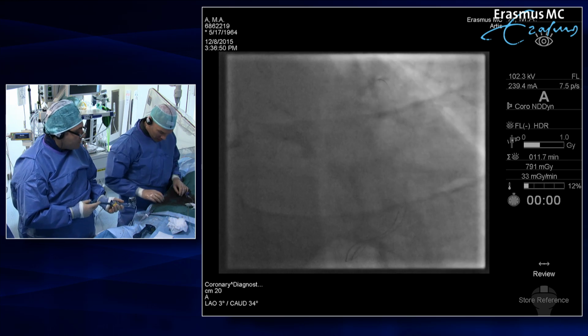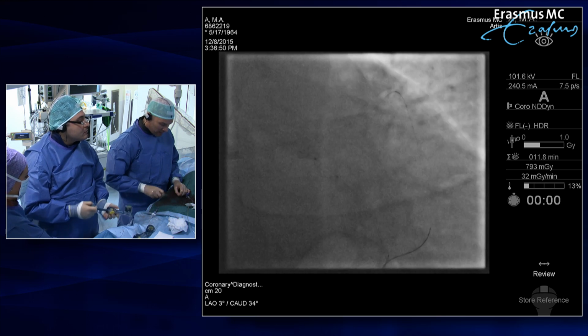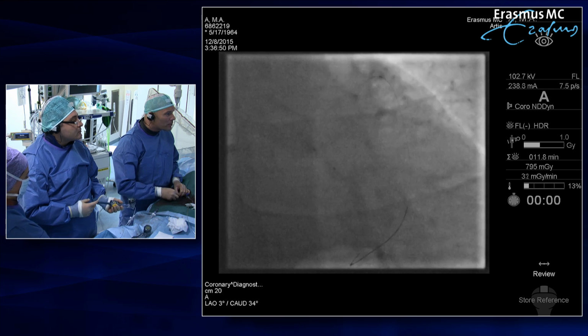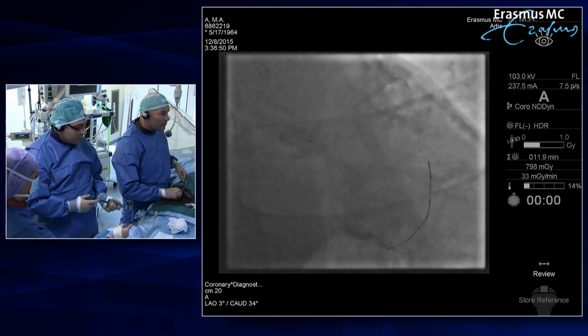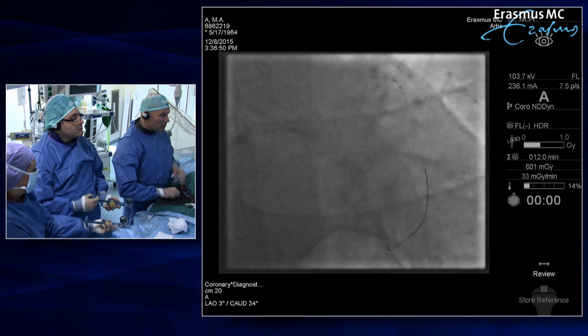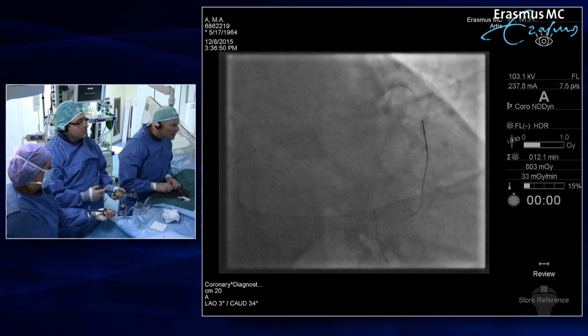Well, talking about IVUS, we are going to do IVUS in principle to finalize this case, because we want to make sure that we have proper stent apposition and stent expansion. Of course, that piece of information you will not get by FFR. So sure. I think invasive imaging and hemodynamic invasive assessment can be synergistic and complementary.